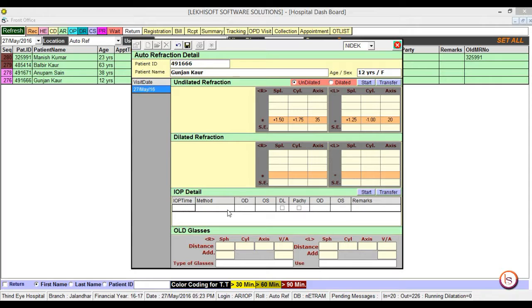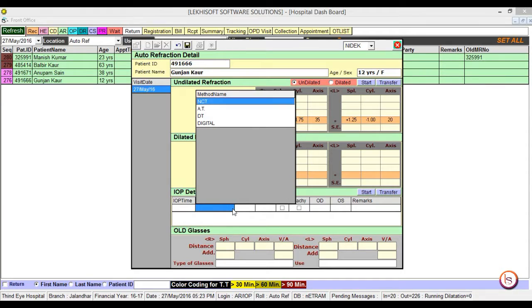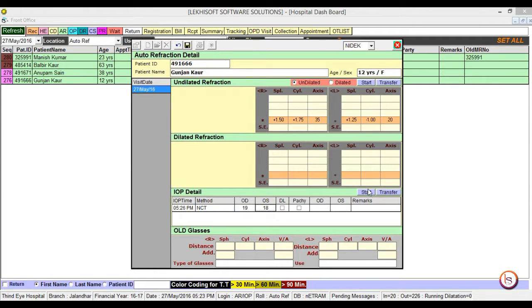Select the method first by which we are going to measure IOP. For example, NCT. Then enter the pressure. You can also transfer the data here by clicking start and then transfer. IOP will be transferred.